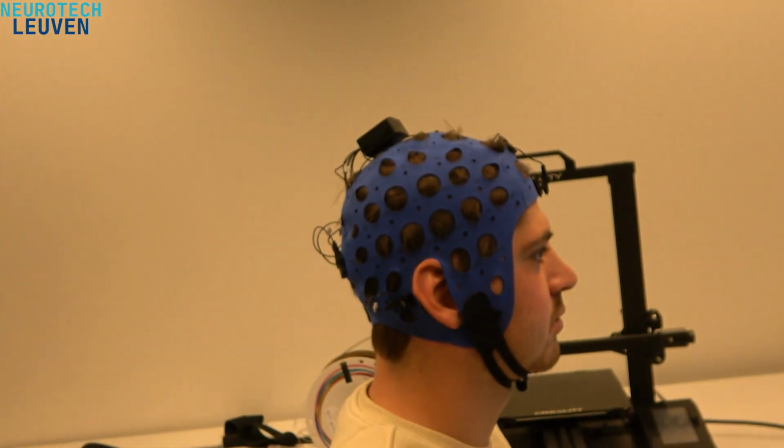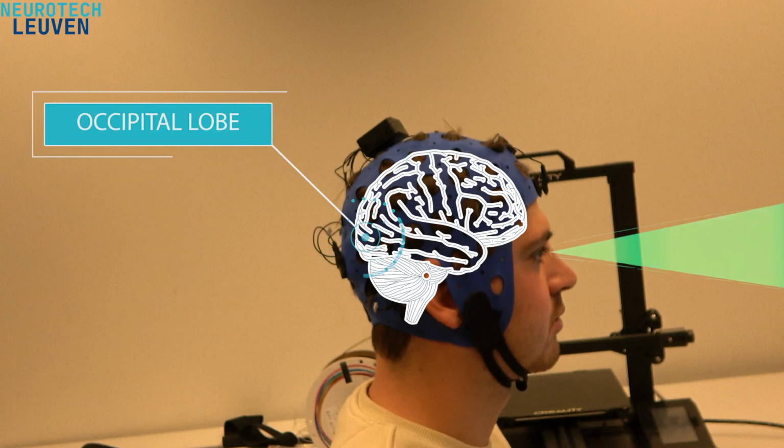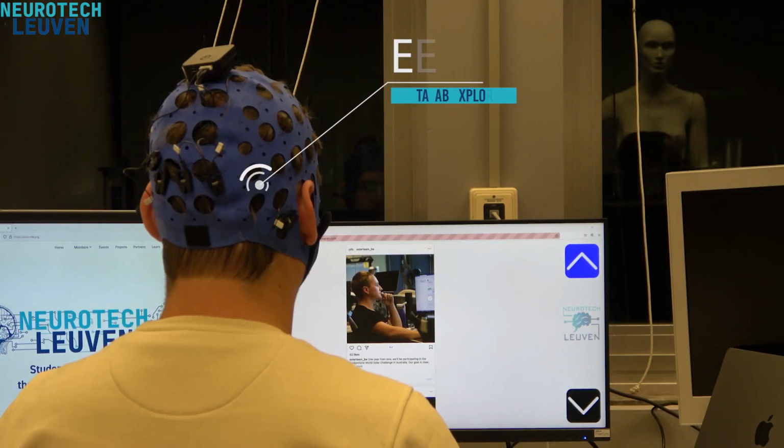While all stimuli on the screen are in the user's field of view, the occipital lobe of the brain reacts strongest to the stimulus that the person is focusing on. Because of the repeated sensory overload of the eyes, the brain generates an electrical potential called a steady-state visually evoked potential. In order to measure this potential, we need specialized hardware, an electroencephalogram headset.